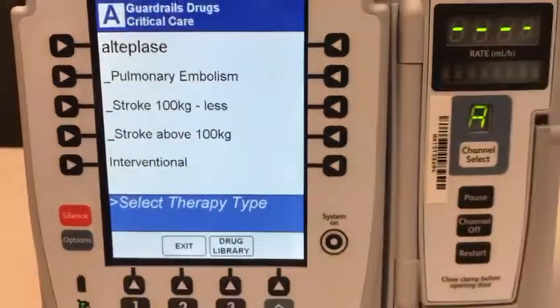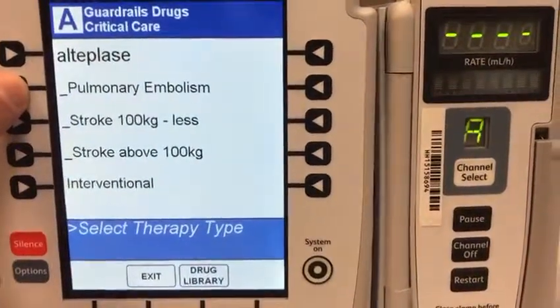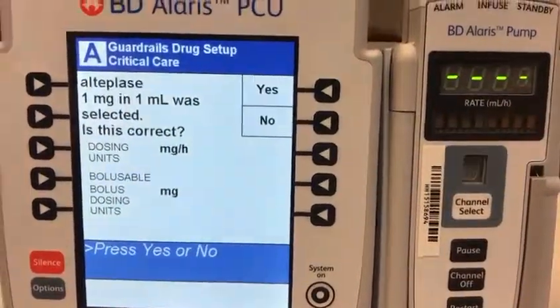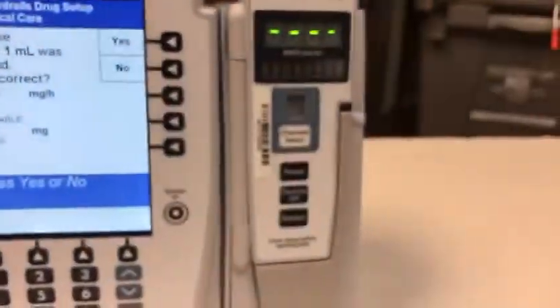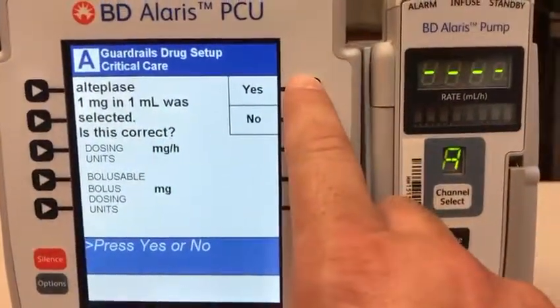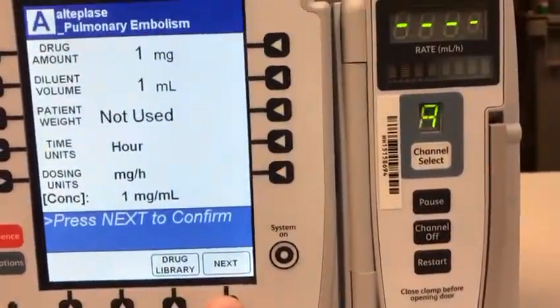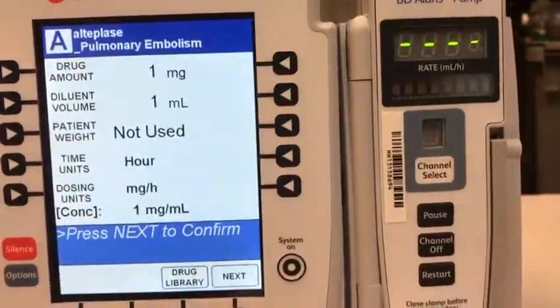In this example, we're going to be giving it for pulmonary embolism. So we're going to select pulmonary embolism, and it's asking us, is this 1 milligram in 1 mil? And the answer to this is yes, because recall that the alteplase is 100 milligrams in 100 mils. So we're going to select yes because it is a 1-to-1 preparation, which is 1 milligram per mil. And then we're going to select next because there is no patient weight. It's the same for all pulmonary embolisms in the adult population.